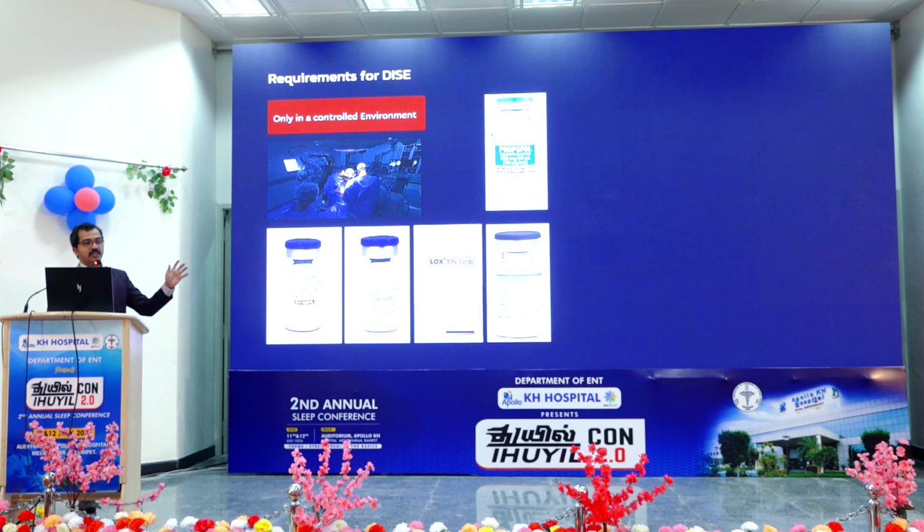And the infusions: for inducing the anesthesia, we will give propofol, and for continuing the sedation, we will use Dexmed, or some people continuously use propofol also. It doesn't matter, because no drug has so far been proven to be the 100% gold standard for DISE.